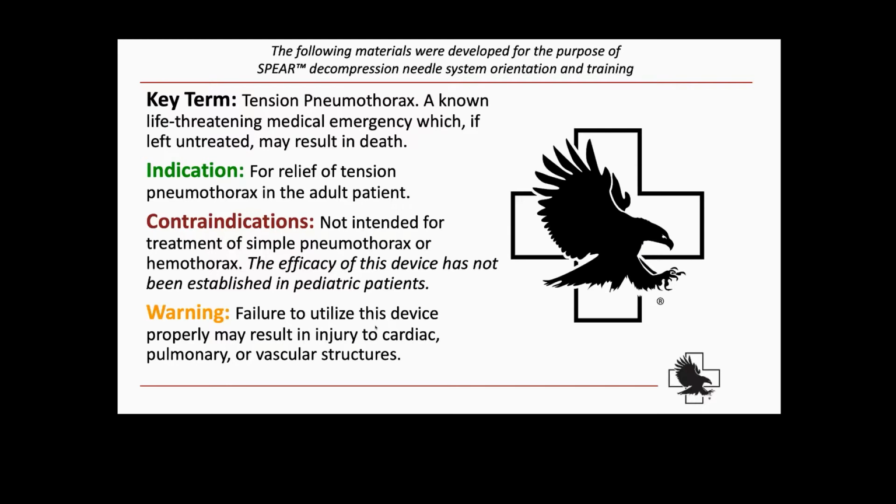And just as a reminder, this is not a device that we use on the pediatric patient, and we only want to be using these devices for tension pneumothorax. Your suspicion could be high for there being a potential pneumothorax, but if it's not causing hemodynamic instability or imminent life threat or presenting with what we describe as the tension physiology, it's not something that we're forced to act on and address. But we have patients that we see in the ED all the time that we find pneumothoraces on, and we don't need to address them emergently with a needle decompression.